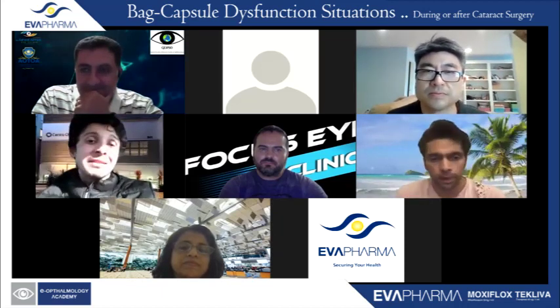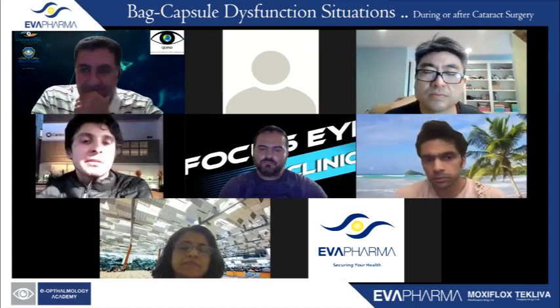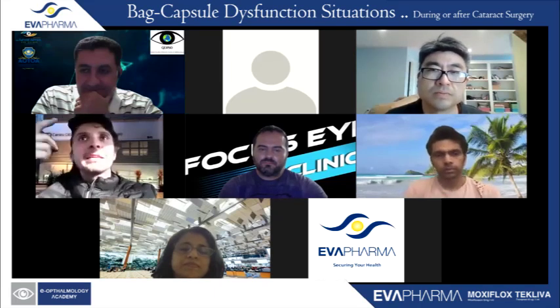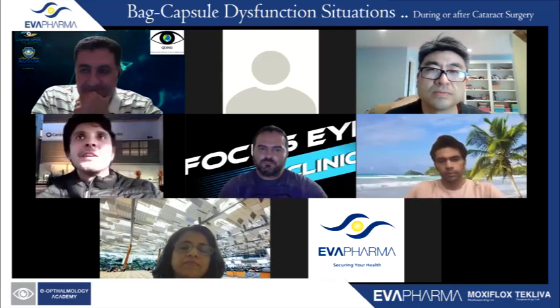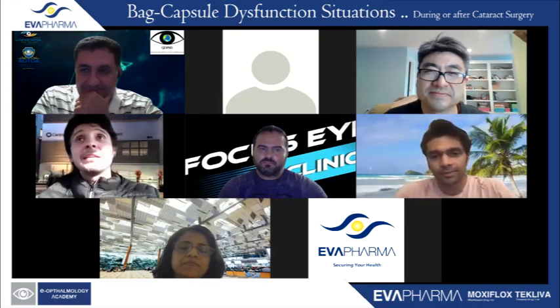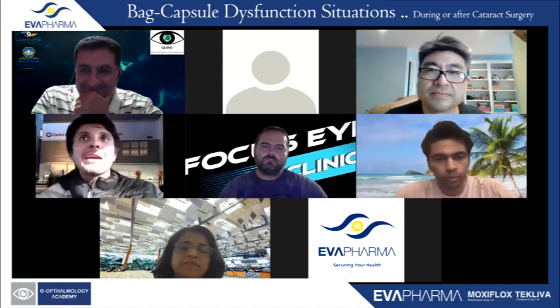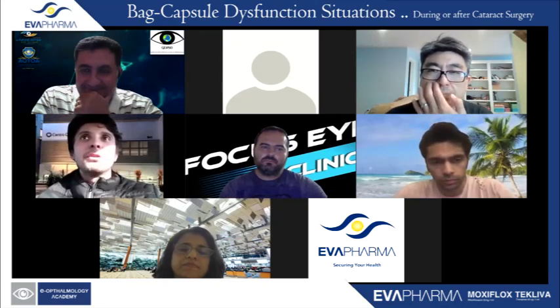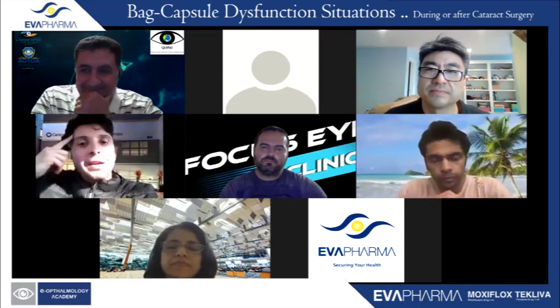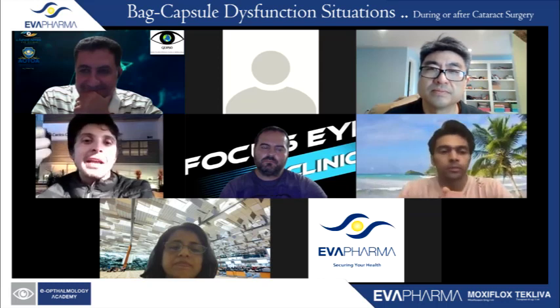But my mistake was I used a 10 millimeter CTR. It was impossible. I tried to put one in, and then I went back. What did I do wrong? I did the more difficult thing. I levitated the ring, the crystalline. I held the crystalline. Why didn't it work? Why did I do a vitrectomy and scleral fixation? Then I realized, man, it's a microspherophakia. The crystalline has 8 millimeters.